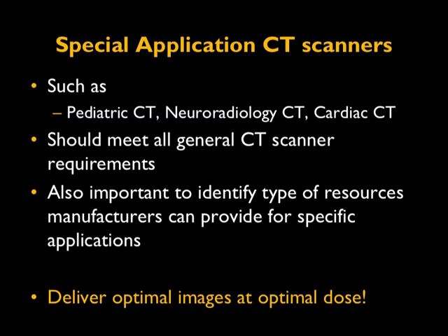First and foremost, the special application CT scanner should meet all the requirements for a general purpose CT scanner. In addition, it is important to identify the type of resources manufacturers can provide for a specific application. It is also important to understand that these special application CT scanners should also have minimal downtime.